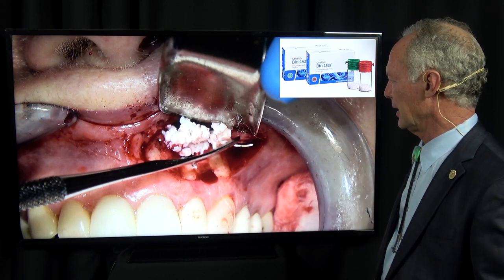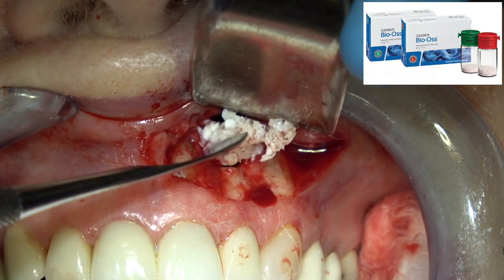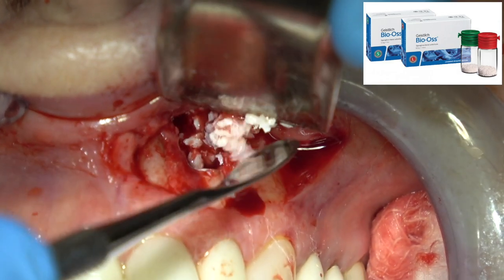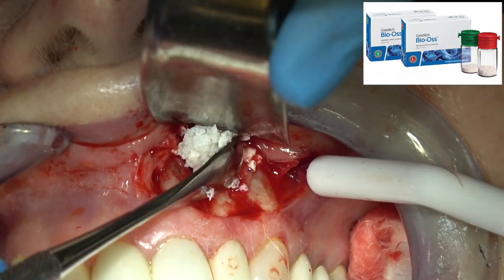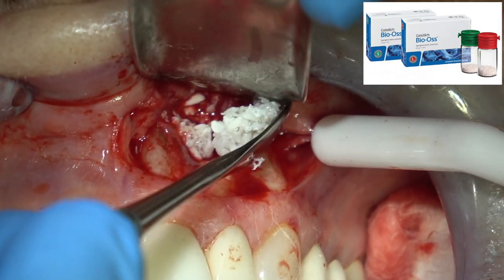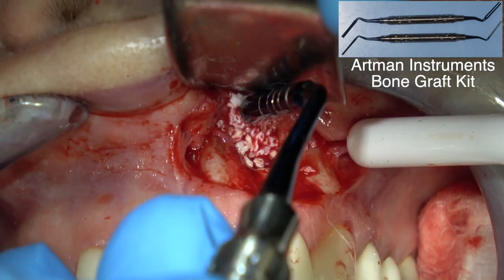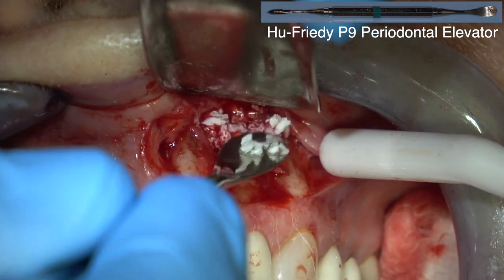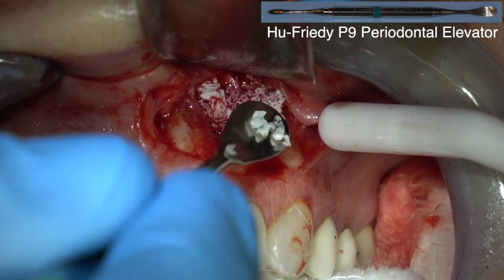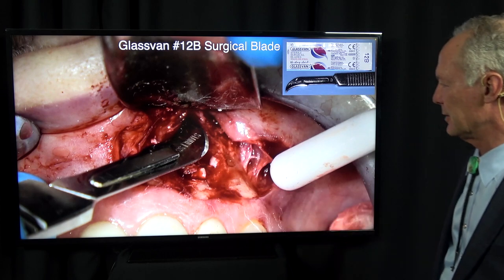I'm placing bone graft material in the site — this is BioOss. Maxius has a good one; there are many bone graft materials. Some people would use platelet-rich fibrin. To use platelet-rich fibrin the patient's got to have a good vein in the antecubital fossa, which this person did not, and it wasn't critical in this situation. If I had extracted a tooth and was placing an implant, I think platelet-rich fibrin is a fantastic material to use either alone or with bone graft material.